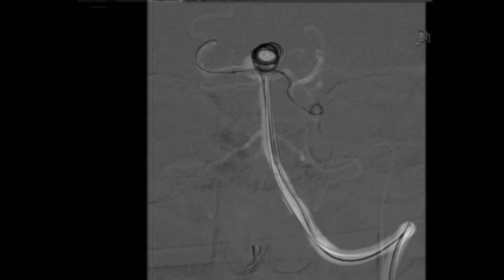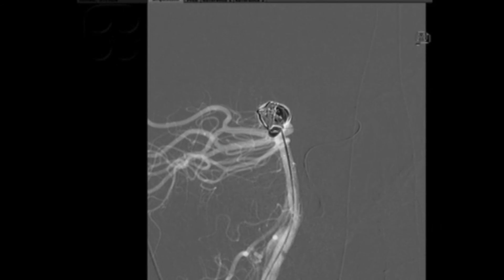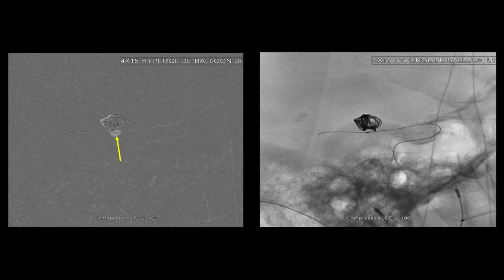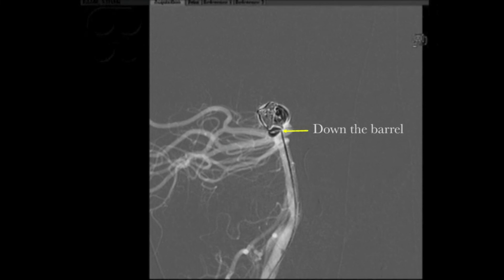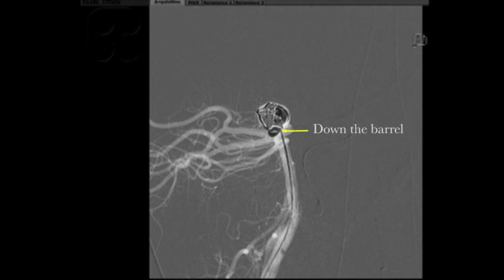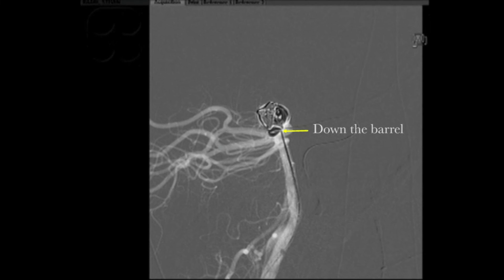At this point, we proceeded with the coiling through the left vertebral artery, while the balloon is coming from the left internal carotid artery. On this roadmap, you can see the impression left on the balloon when it is inflated, and we can see the coiling going from the vertebral artery into the basilar tip aneurysm. On the sagittal roadmap, we can see the progressive coil occlusion of the aneurysm with a down-the-barrel view, establishing the view from one PCA to the contralateral PCA. Once the balloon is inflated, you can see that the neck is completely protected.